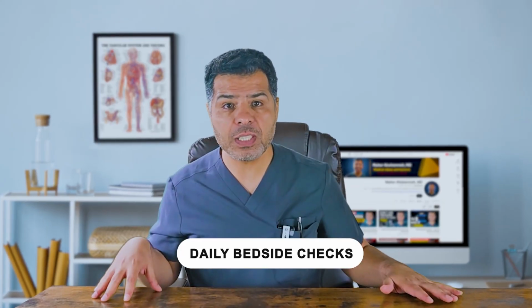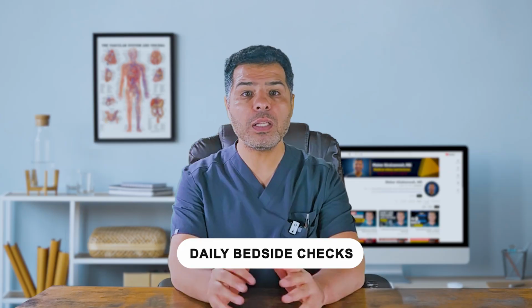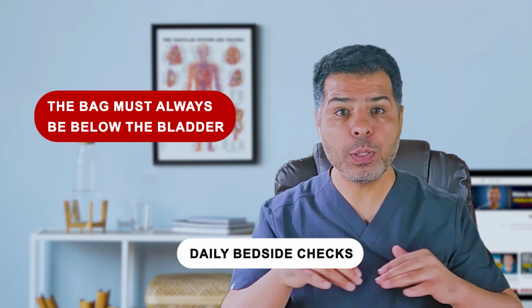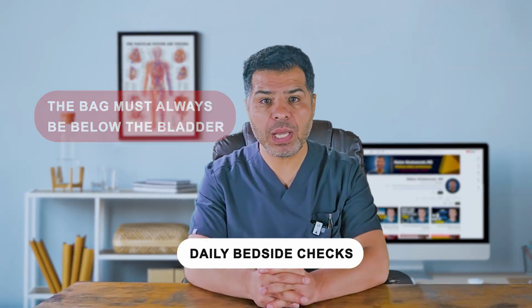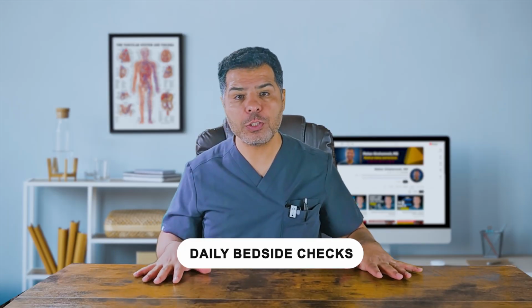If you meet resistance, do not force it. The catheter might be clogged with sediments, blood clots, or malposition. And don't forget to check the drainage bag position. The bag, again, must always be below the bladder level but not touching the floor. Never let it rest on the bed rail or hang above the bladder. This causes backflow and dramatically increases infection risk.